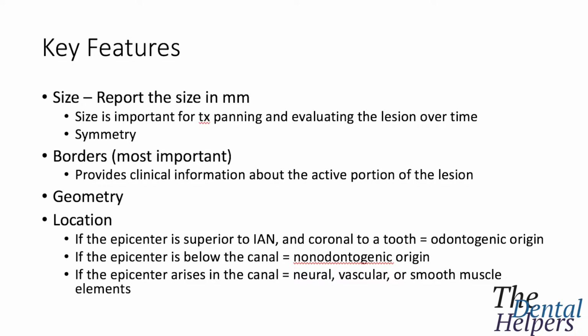And if it's going to be in the canal, it's going to have three different types based on the tissue type that it's involved with. So it could be neurovascular or smooth muscle elements. So let's first look at size.